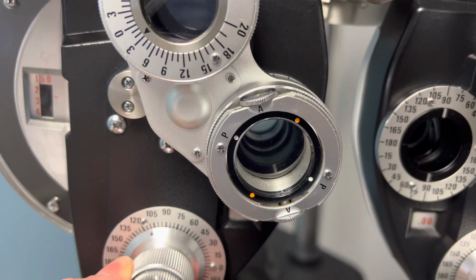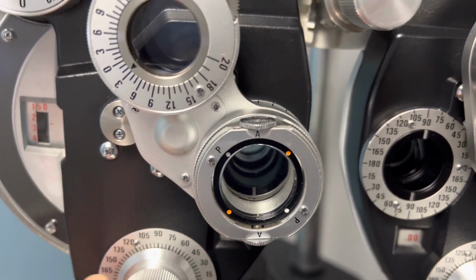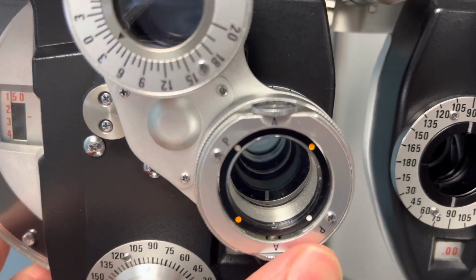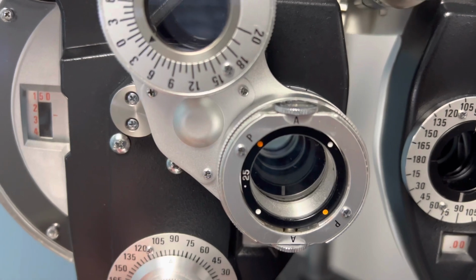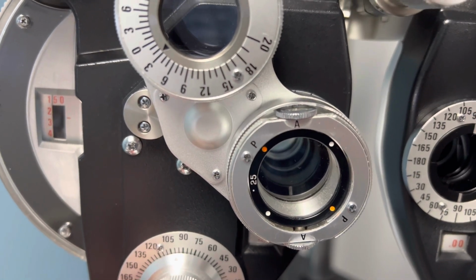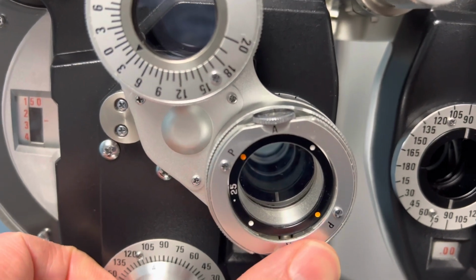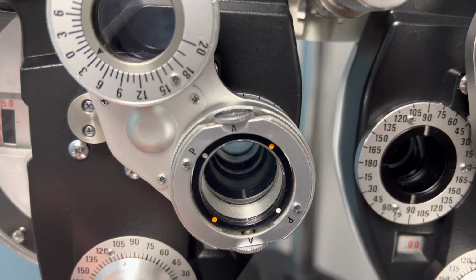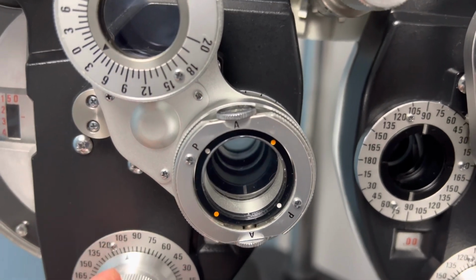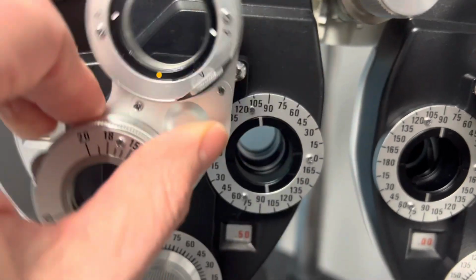If you pick 3, we're going to turn the dial back a little bit more this way. And then I'll ask again, which is better, 3 or 4? If you pick 4, we'll go a little bit more back this way. And I'll ask one more time, which is better, 4 or 5? And you say, I'm really not sure, it looks about the same. That means we've found where we want to be, and this means we're going to stop.